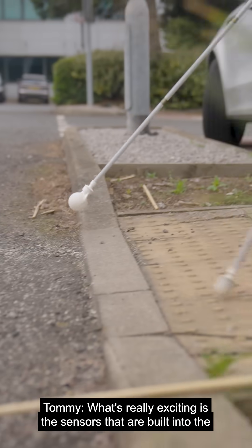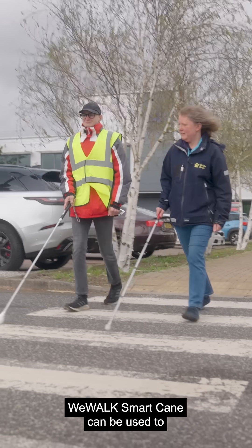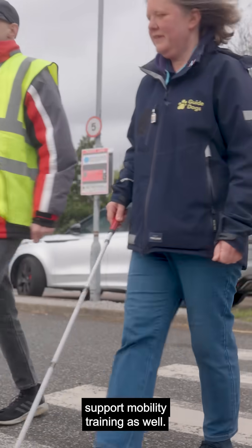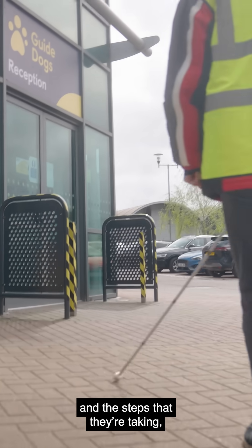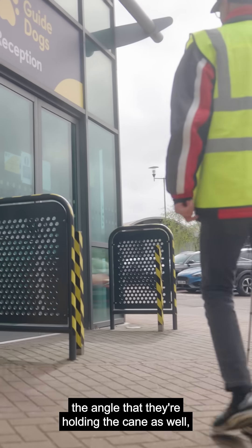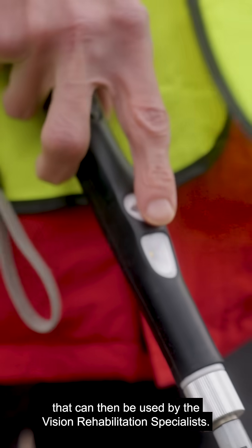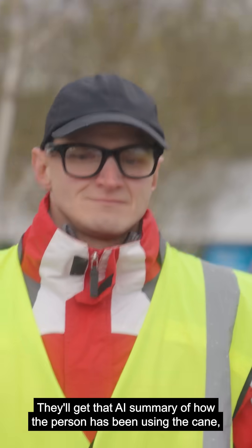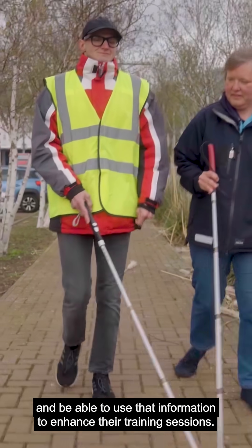What's really exciting is that the sensors built into the WeWalk SmartCane can be used to support mobility training as well — how wide they're sweeping the cane, the steps they're taking, the angle they're holding the cane. That data can then be used by vision rehabilitation specialists, who'll get an AI summary of how the person has been using the cane and be able to use that information to enhance their training sessions.